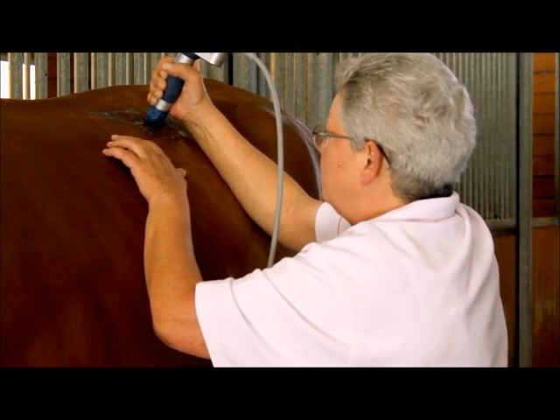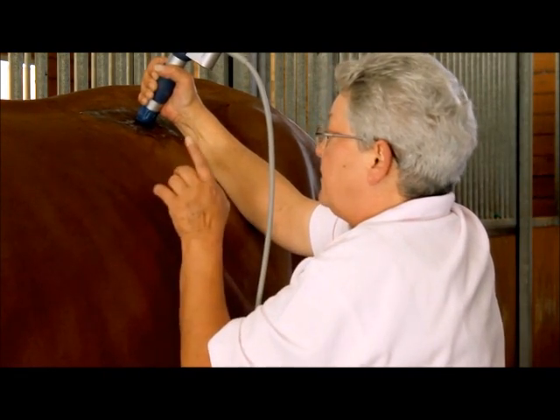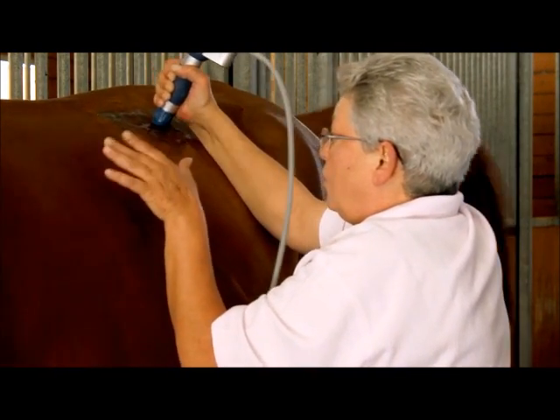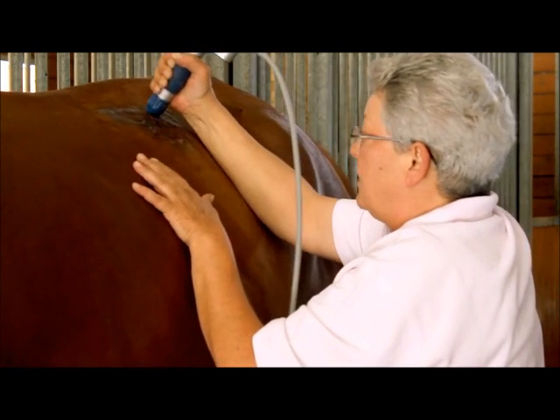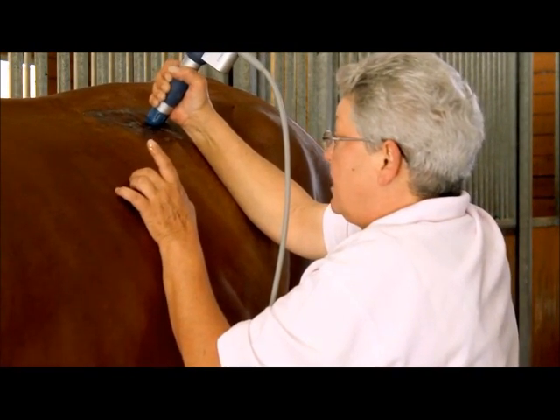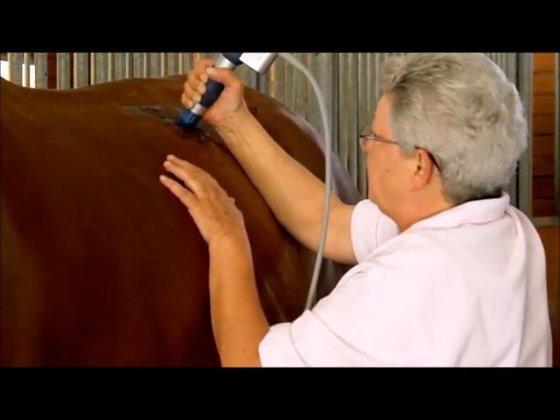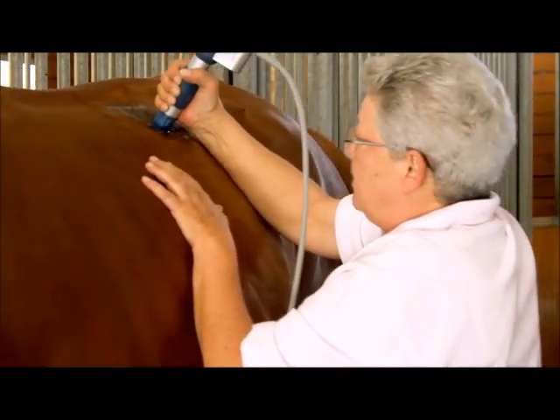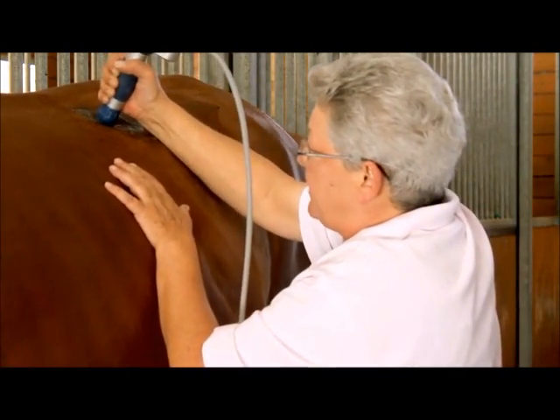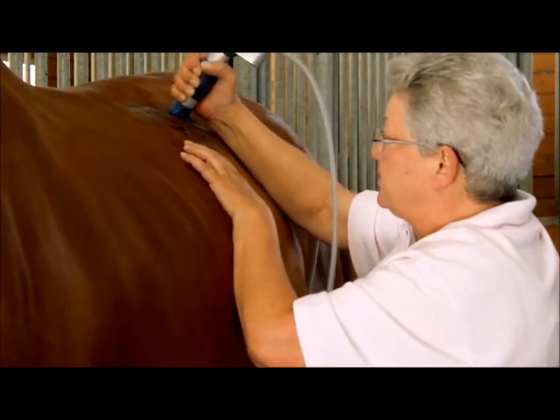Do you need any sedation for the horse? No. The only thing is that you really observe the horse's reactions and the muscle reactions. And now you can see I have at least 80-90% less reactions in the muscles here than I did when I started.